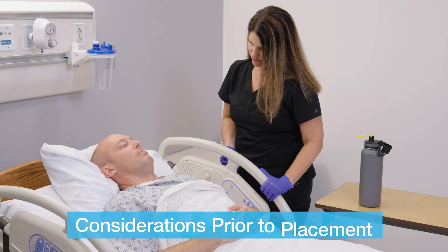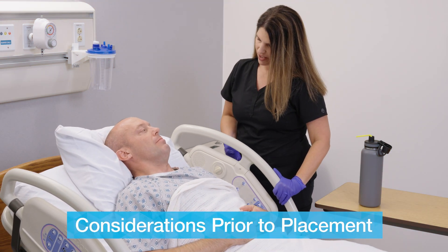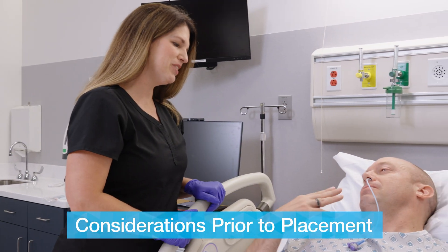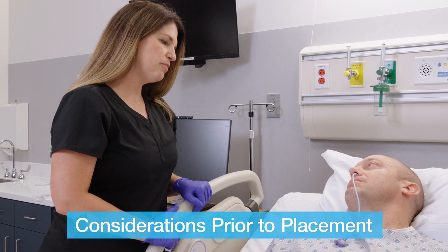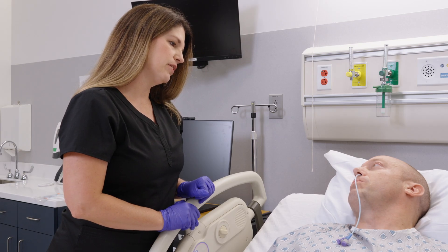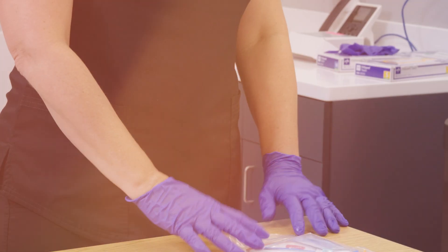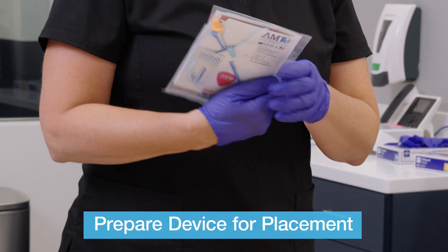Prior to beginning placement, it is recommended to have the patient in a supine position. The AMT Bridal Pro may be placed before or after the nasal tube at the clinician's discretion. Confirm the patient is a good candidate for bridal placement and ensure that no contraindications for use are present. With these considerations, you may now begin placement.